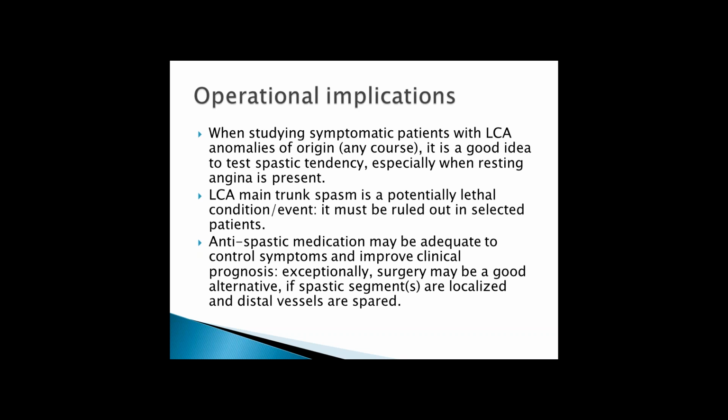Nitroglycerin should be given after pulling acetylcholine and not following acetylcholine in the catheter, because the catheter contains about 25 micrograms of acetylcholine. So it will increase the effect if you don't flush with saline before, after pulling the content of the guiding catheter.